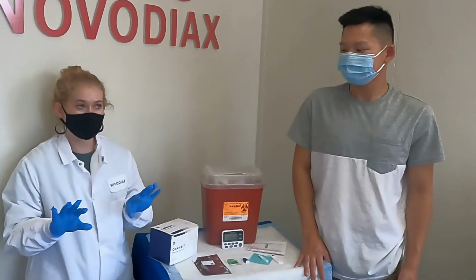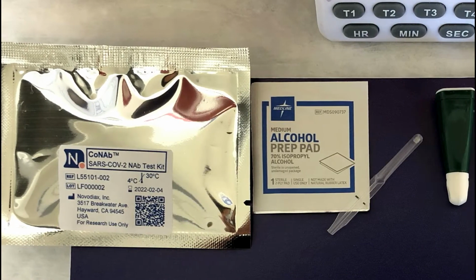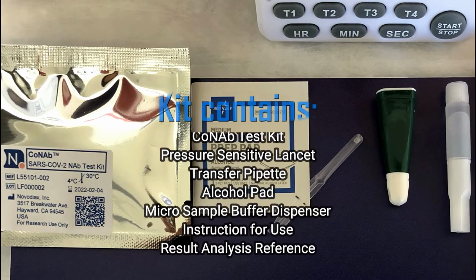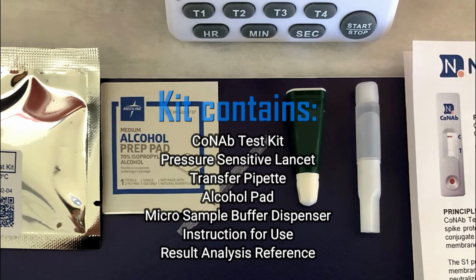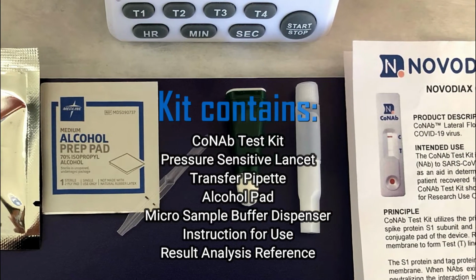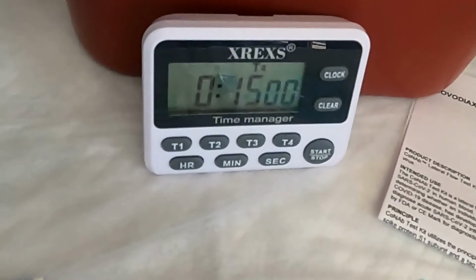Before getting started, make certain to have personal protection and all of the necessary items for testing within reach. The kit should contain the following: an alcohol swab towelette, lancet and transfer pipette, the CoNAb antibody cassette, and a dropper bottle containing the diluent. There are two types of dropper bottles you could receive. Please read the instructions for use to determine how many drops of diluent to dispense. Finally, have a stopwatch or other timing device available for use.